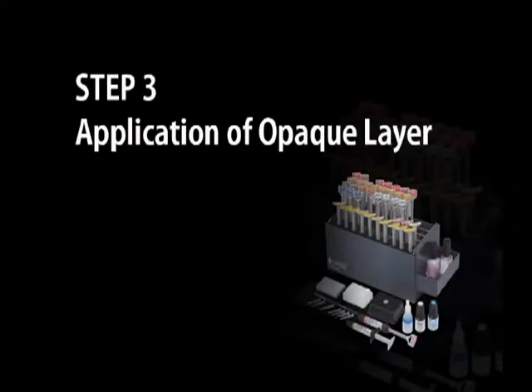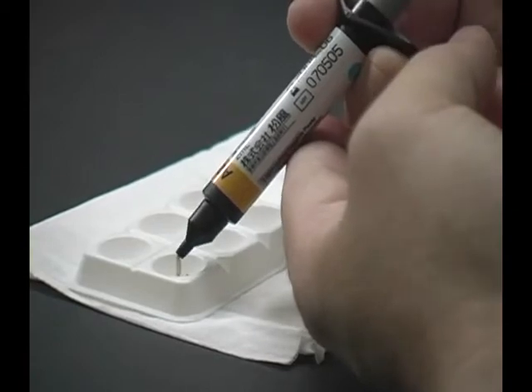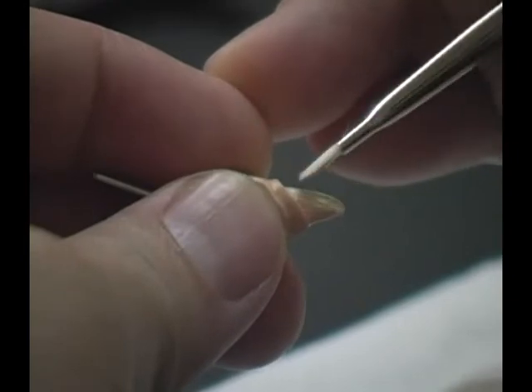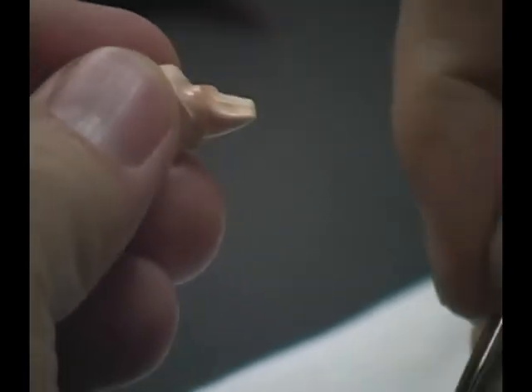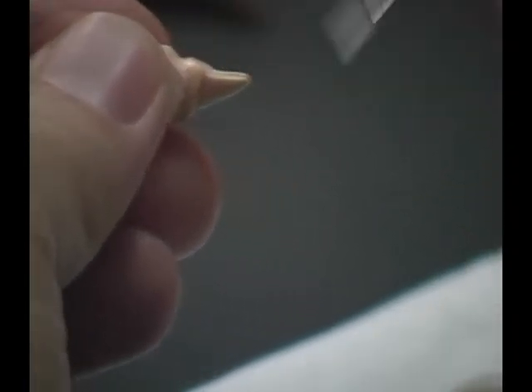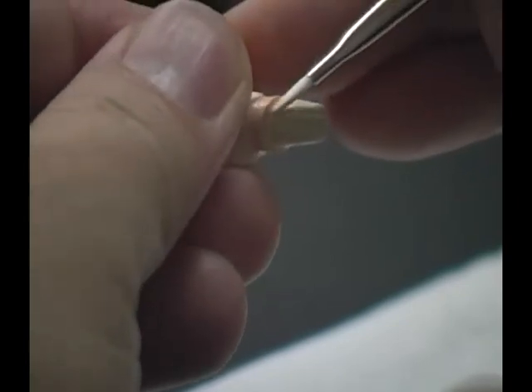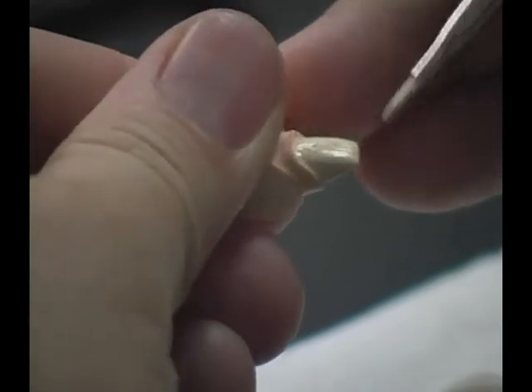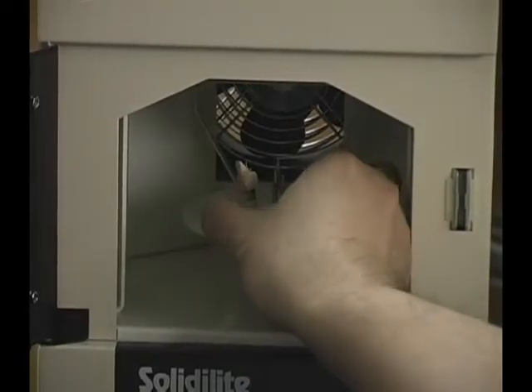Application of Opaque Layer. Dispense the Ceramage Flow Opaque A2O into the mixing dish. Then apply a thin even layer using a brush to cover the entire surface completely. Do not apply the opaque on the margin marking area. Place the die on the tray and light-cure in the Solidilite curing unit for 3 minutes.